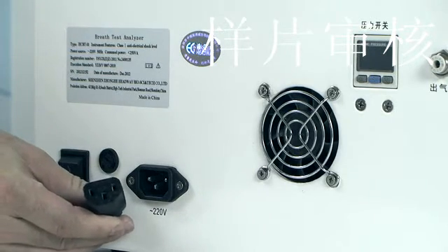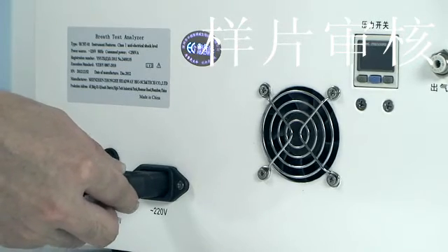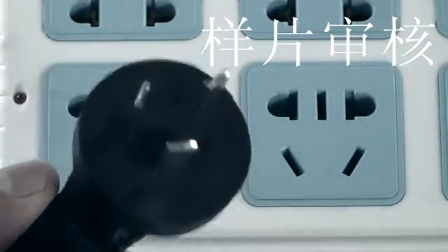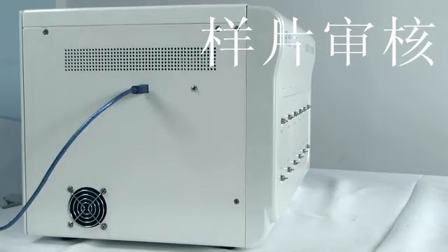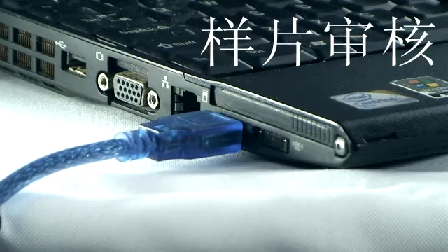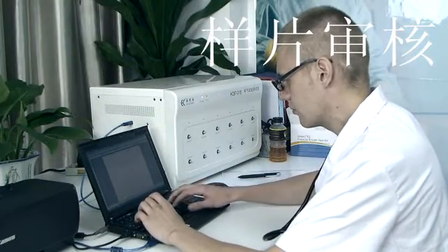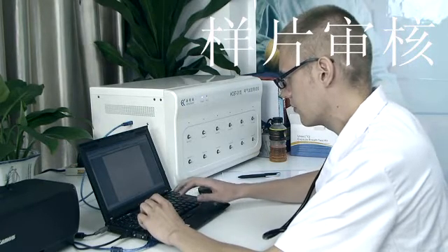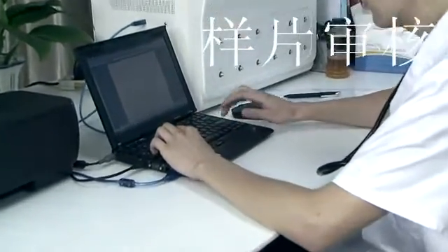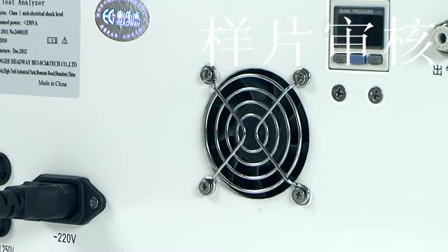Before operation, check if the power switches are on the OFF (O) scale and whether both sides of the power line are in place. Check the connection between the instrument and the USB communication cable. Check that the user computer works normally. Check if the communication cable between the printer and computer is connected, whether there is printing paper in the printer, and whether the printer runs normally. Check if the fan and cooling holes of the instrument are blocked or covered.